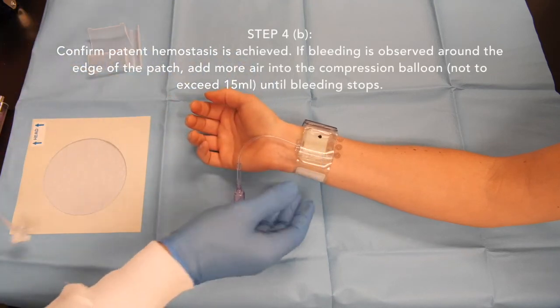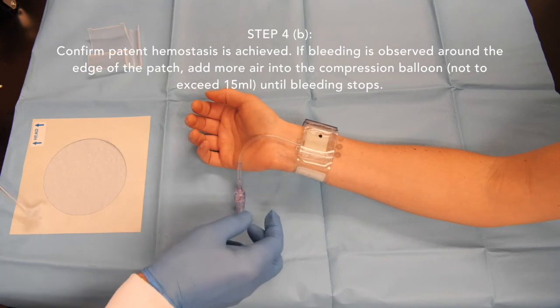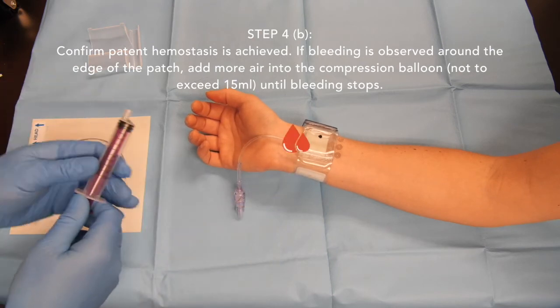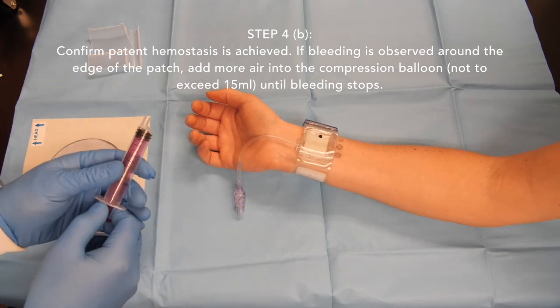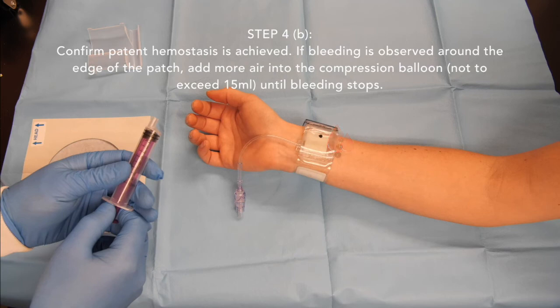Confirm patent hemostasis is achieved. If bleeding is observed around the edge of the patch, reconnect an air-charged syringe to the air valve and add more air to the balloon in 2 ml volume addition steps until bleeding stops. Total addition of air to the balloon should not exceed 15 ml.